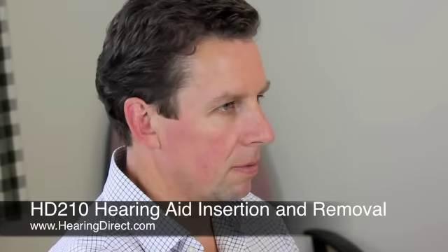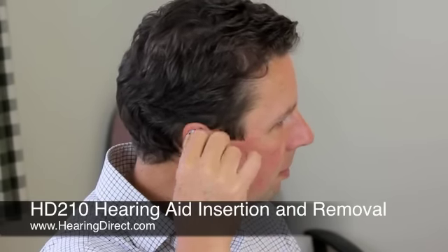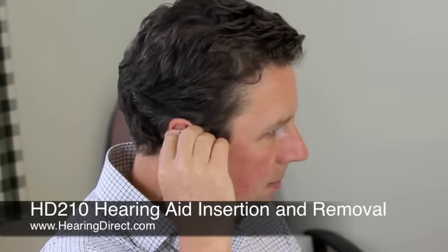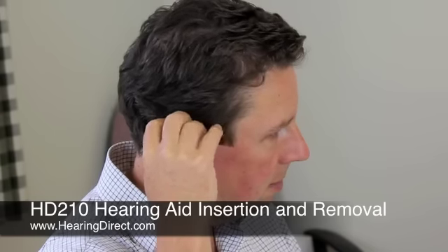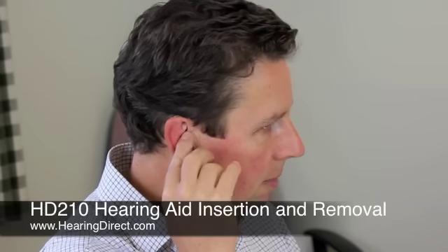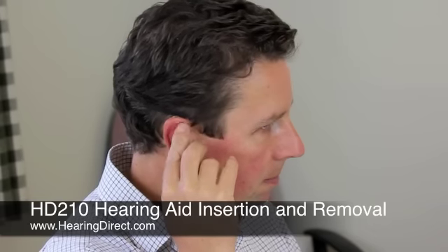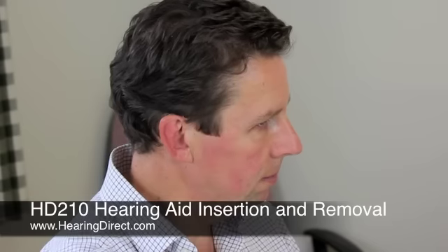When it comes to putting in the HD210, some people prefer to put the tubing in first into the ear canal and then hang the rest of the instrument behind the ear. Other people may prefer to put the back on first and then the tubing into the ear canal. Whichever way you find comfortable to put it in, the aim is to have a comfortable fit where the tubing is fairly flush against the side of the head.